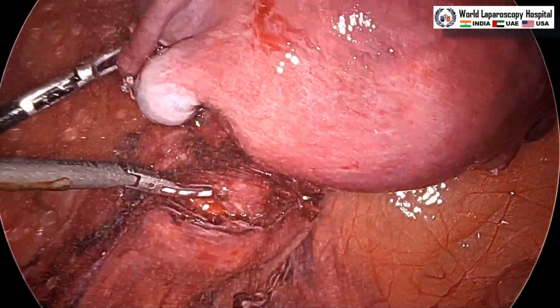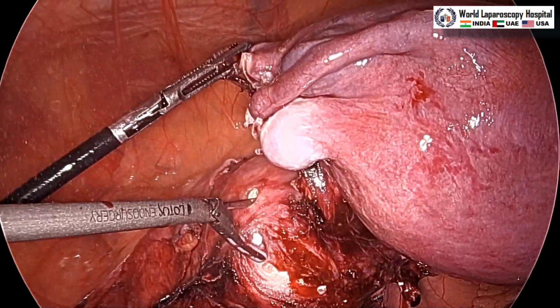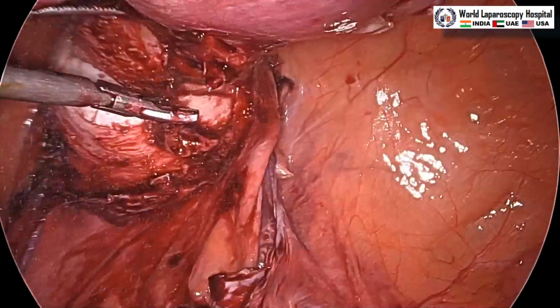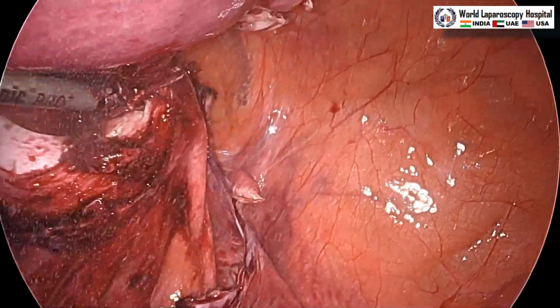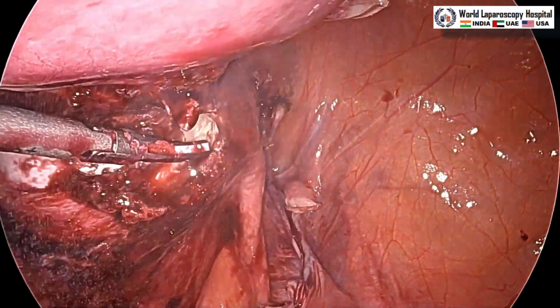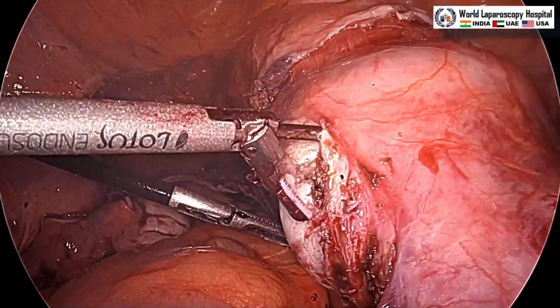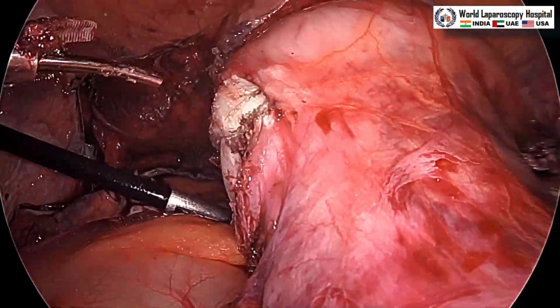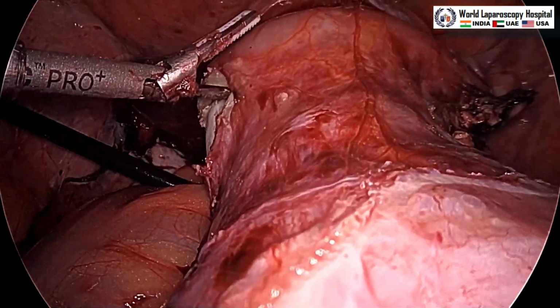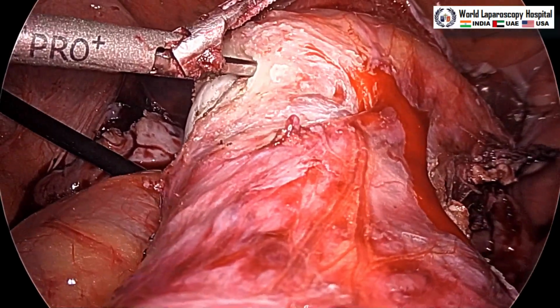Again, this is the harmonic scalpel which is doing the colpotomy. While you are doing colpotomy, it should be rotated all around and the colpotomy should continue slowly. During the colpotomy, be careful that the assistant should synchronize with your movement of the vibrating jaw of the harmonic, and you should keep the jaw open, because if you keep it closed, then the Teflon tip of the harmonic will cut. So, this is slowly the anterior colpotomy, and it is also very important that the assistant should give the maximum cranial traction possible, because if the vagina is stretched, you can cut it very easily.